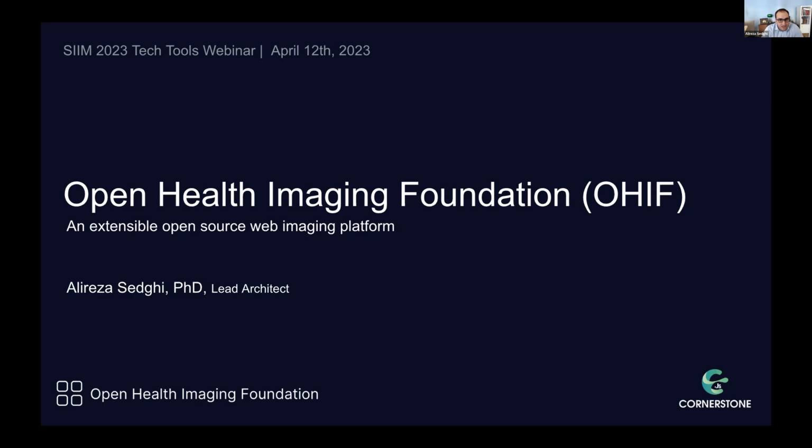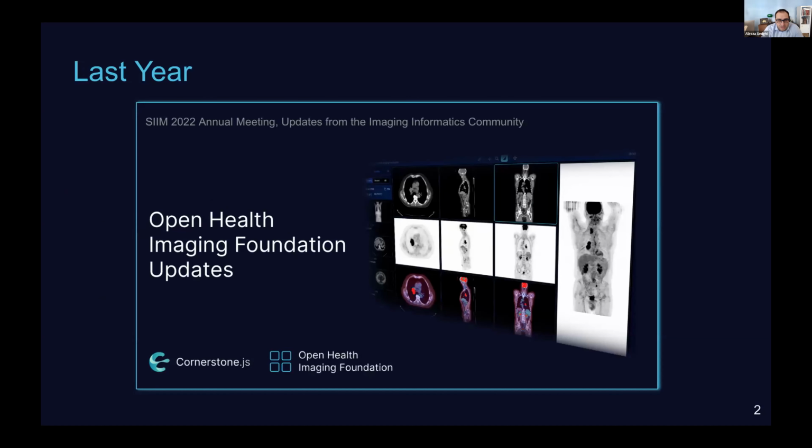This is a great meeting indeed. So hello, everyone who joined today. My name is Ali Reza. I'm the lead architect for OHIF. Today, I'm going to talk about our platform, OHIF, which is an extensible open source web imaging solution for medical imaging. As a matter of fact, I gave another presentation at SIIM last year. I shared some information about OHIF, and today I'm back. I will go over the introduction for our platform for those who are new, and also dive into the latest changes of the platform for everyone else that knows OHIF. And I hope this will be an exciting catch up for everyone.